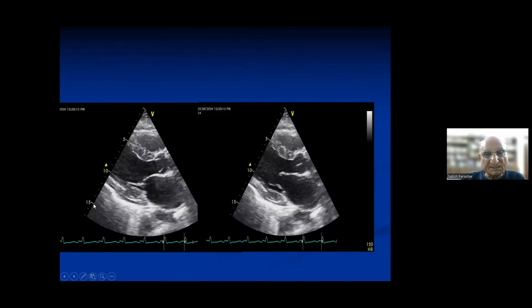So, for example, here you see this is a parasternal long axis view. The mitral valve is closed and the aortic valve is open. So that means it is systole, because the aortic cusps open in systole and close in diastole, and the opposite in diastole. You see the mitral valve opens, and during diastole, see the LV size increases as compared to systole. So even by this you can know the aortic valve closes and the mitral valve opens in diastole, it fills up the LV, so the size increases. This is the basis of diastole and systole, that the chamber size increases or decreases.